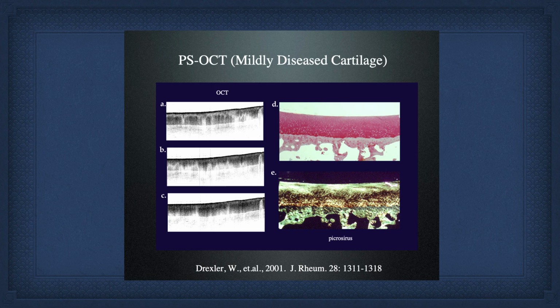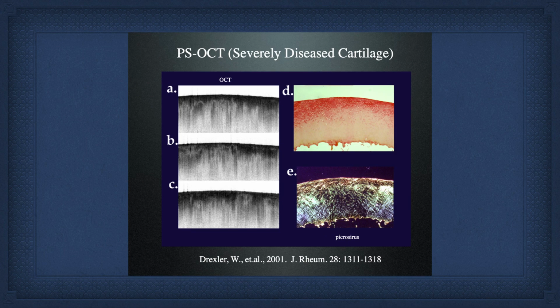You see dropout areas. And if we go to the OCT images on the left, it's not a smooth band. We've lost some of it; some of the areas aren't behaving as nicely. And H&E is in the upper right-hand corner, and that's only relevant in the next one. So this one was great.